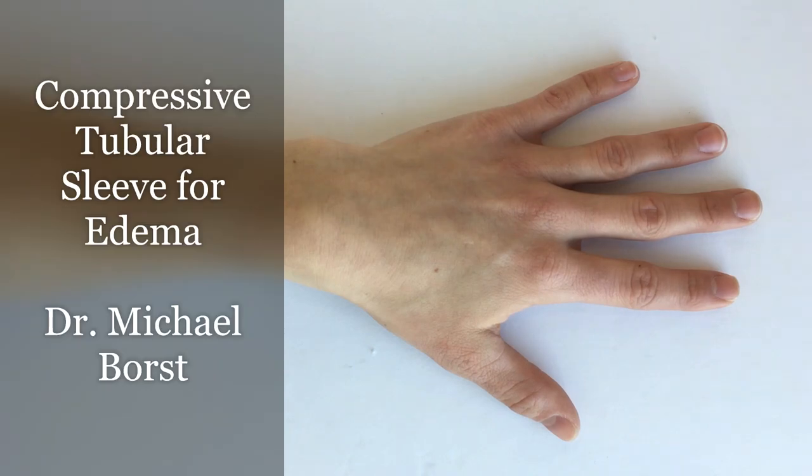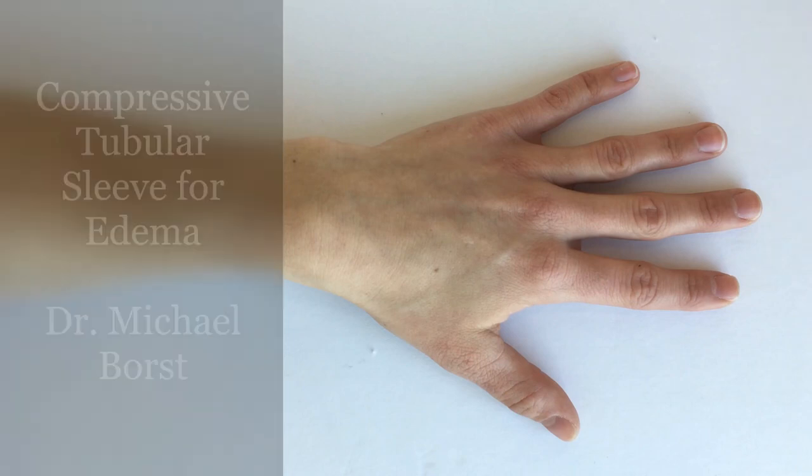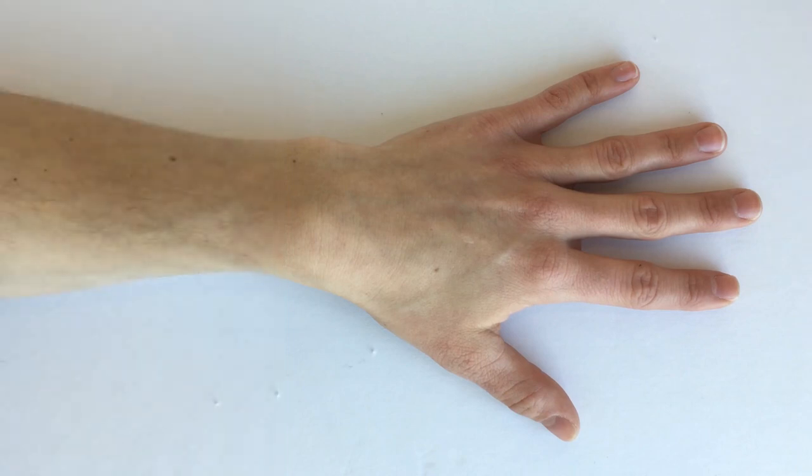If your client has edema in the wrist and/or the forearm, you can use a compressive tubular stocking like Tubigrip or Tensile Grip to address that.